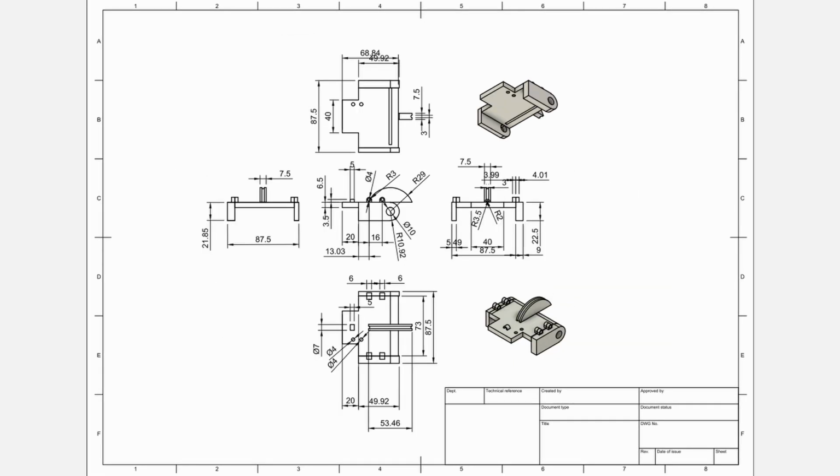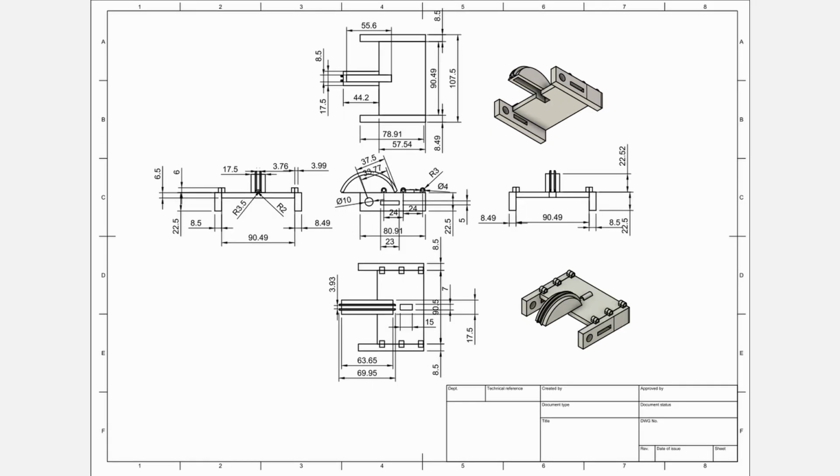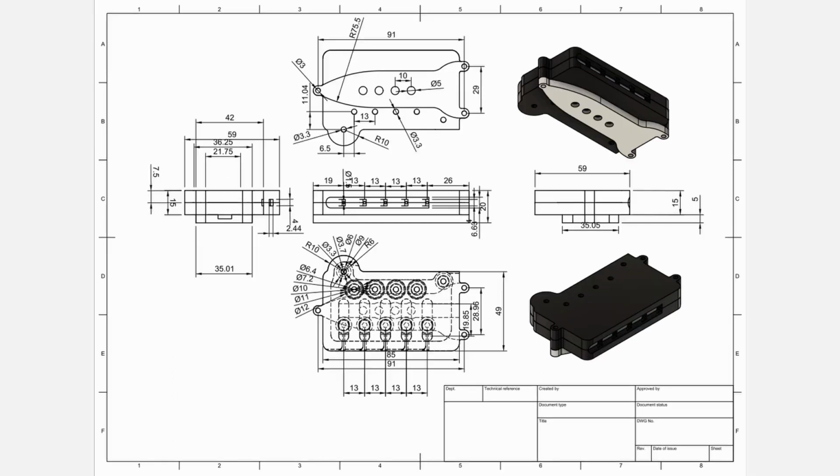Then we designed the elbow link, which is going to pull the string which is used to actuate the fingers of our design. Following are the images of CAD drawings with dimensioning of the elbow links. At last, we designed the CAD model of our pulley mechanism, and here is the CAD drawing with dimensioning.